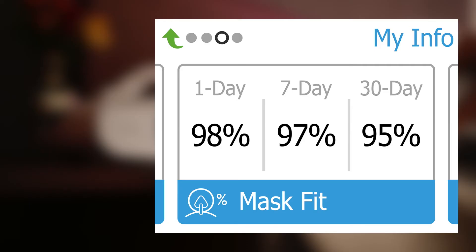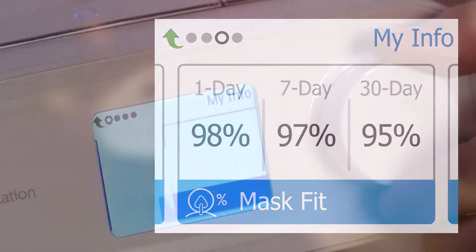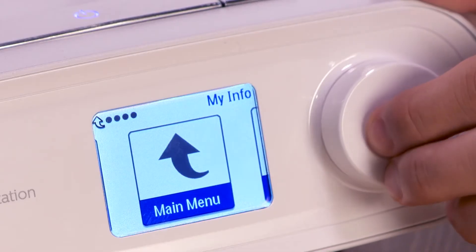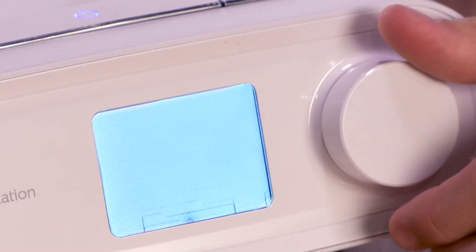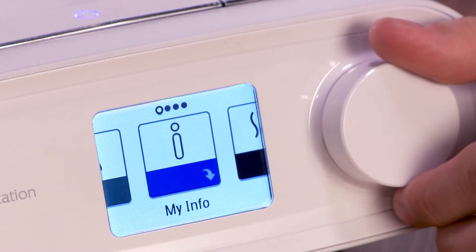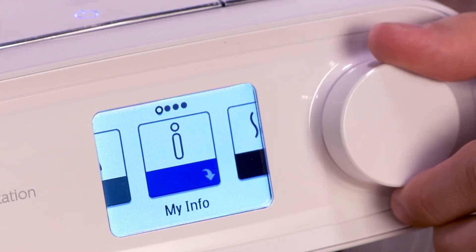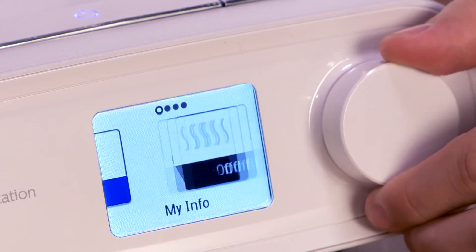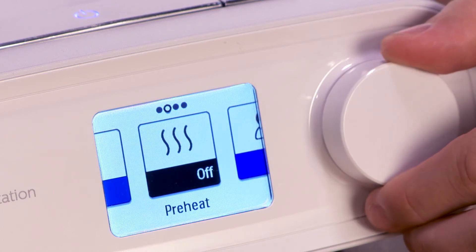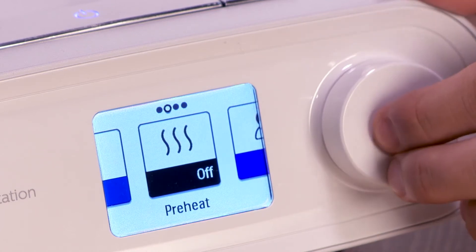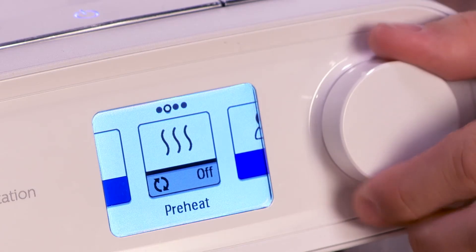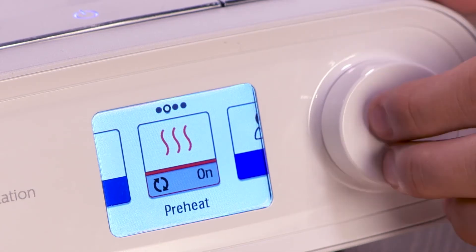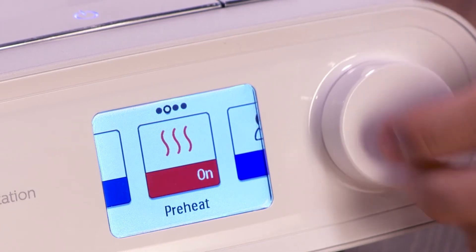From a submenu, rotate to the main menu screen and push the dial to return to the home screen. If you have the optional humidifier on your DreamStation, you will see the Preheat screen. This screen allows you to warm up your humidifier for up to 30 minutes before you start your therapy session.